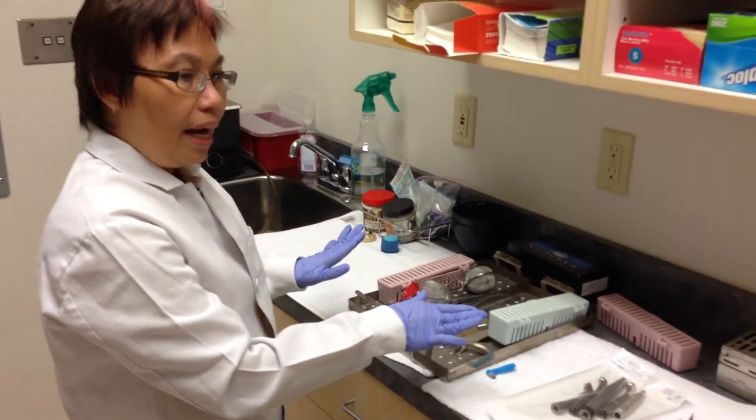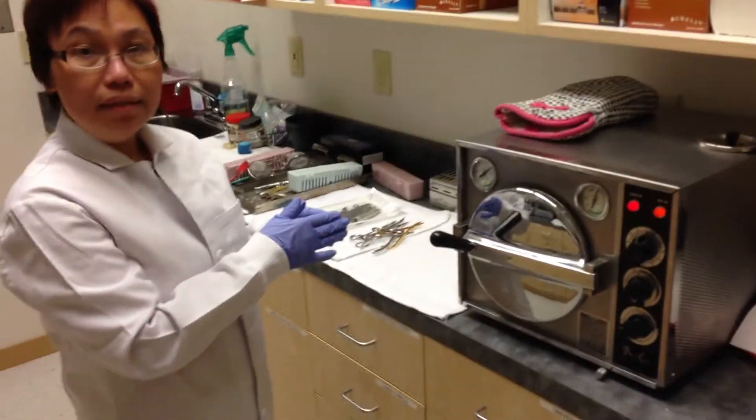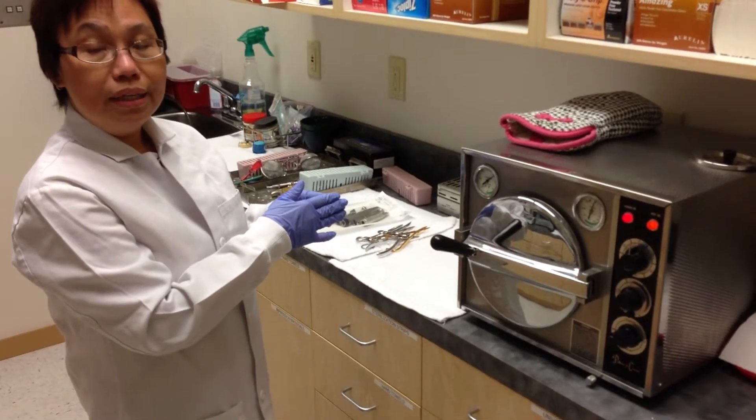After this, they are put into the autoclave machine at high temperature and high pressure to kill all bacteria.